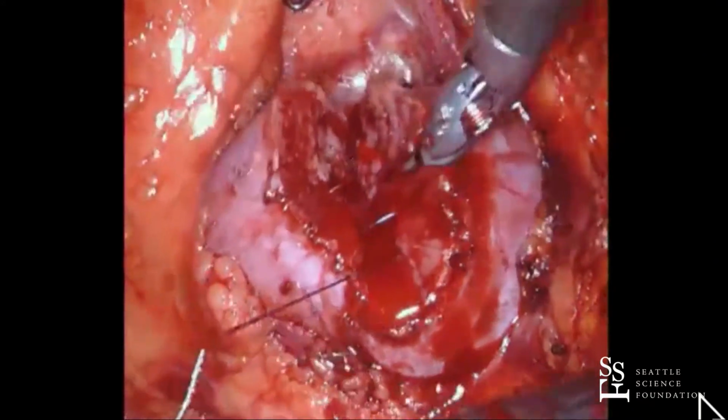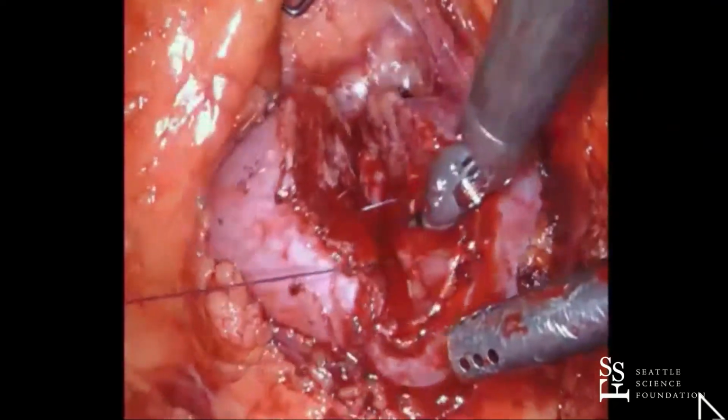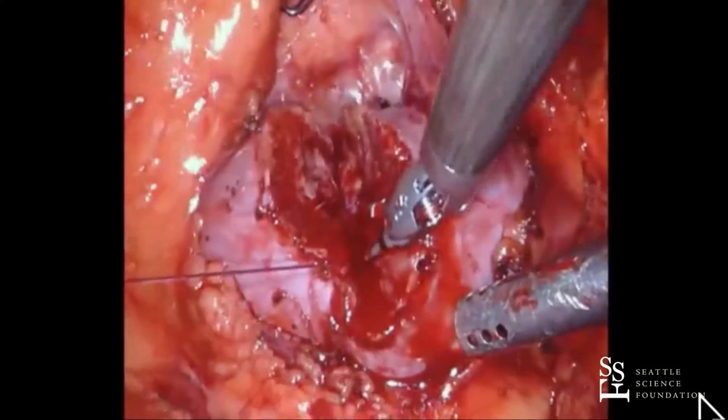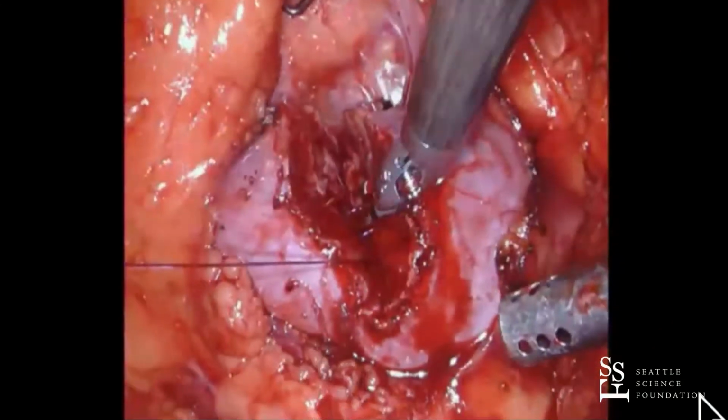Okay, so now I'm going to sequentially take the swage out. Watch what happens to the base here. You see? Yeah, that's nice. And it's going to get even tighter when I pull on each end.